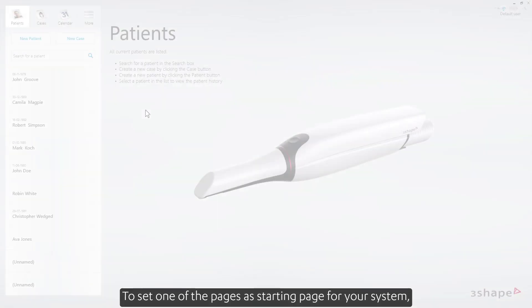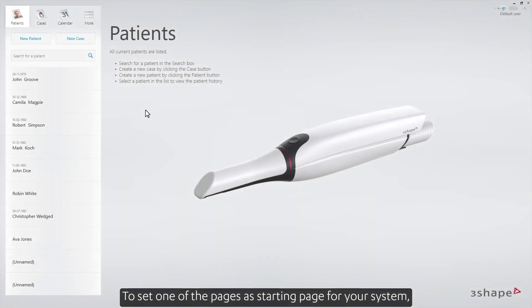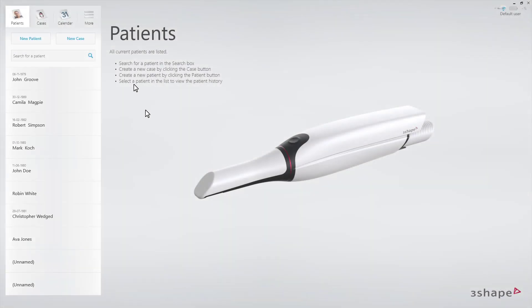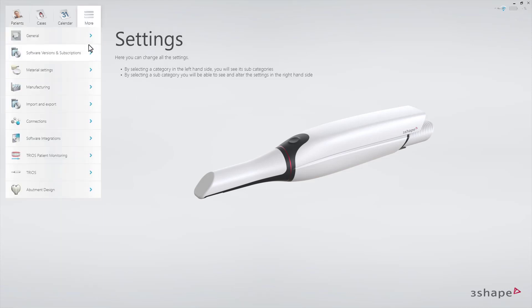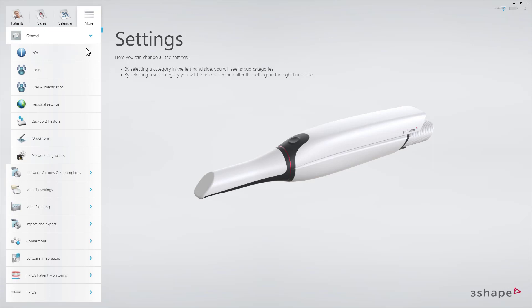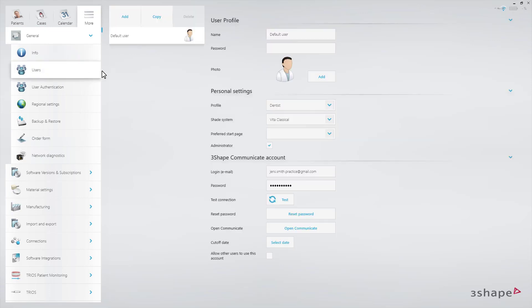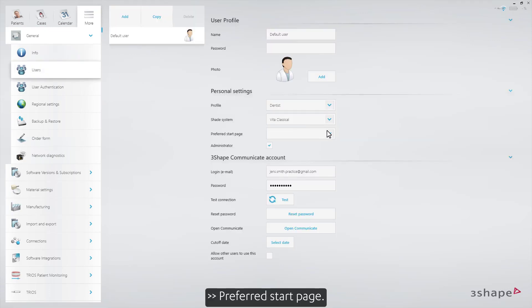To set one of the pages as the starting page for your system, go to More, Settings, General, Users, Preferred Start Page.